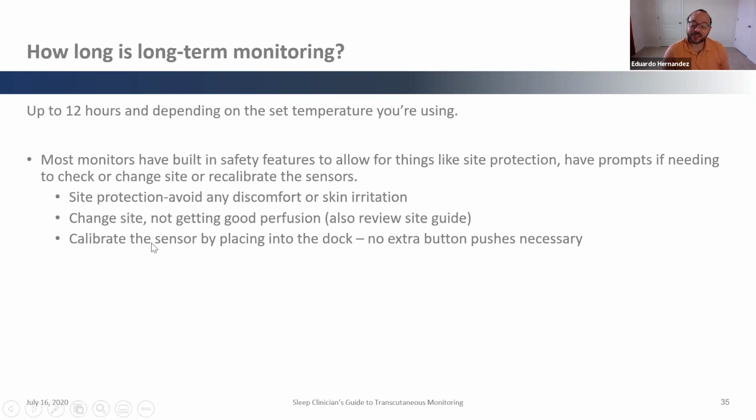Now, if we're talking about outside of the sleep lab, maybe in a NICU or PICU setting, because sometimes inpatient sleep studies are done, this is also very important to be able to continuously monitor that.